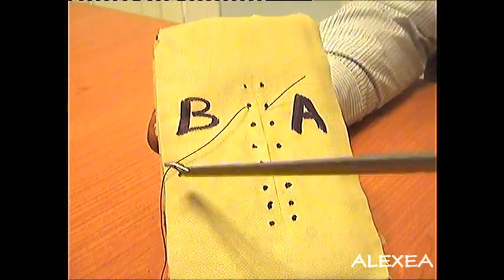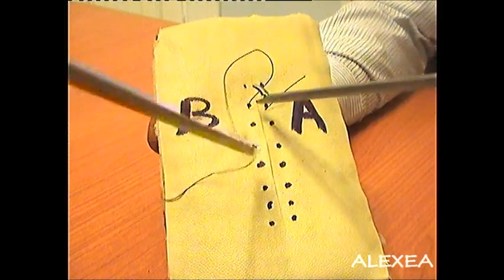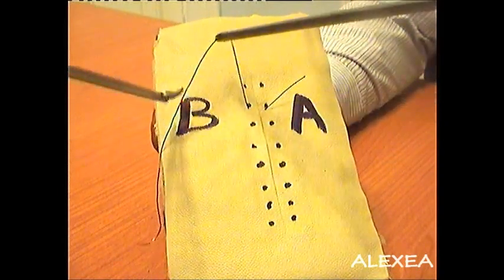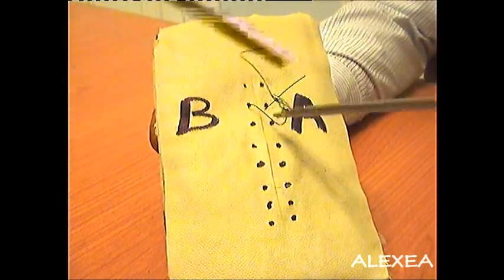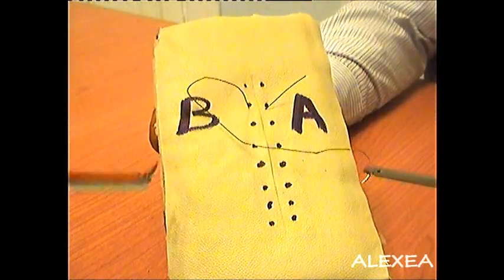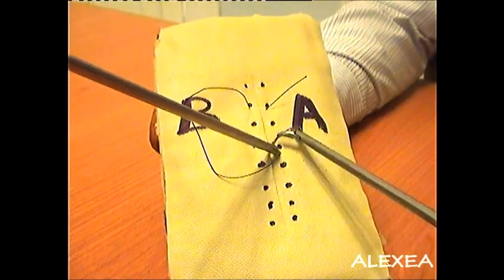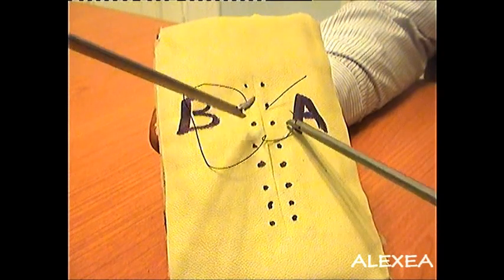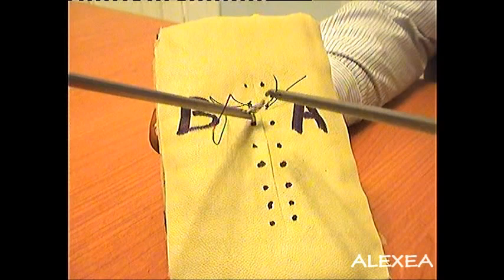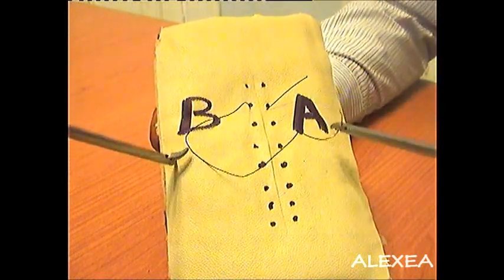Now to prepare the knot tying, one takes the long end of the stitch to side A and holds the needle at its tip. It is preferable to hold the needle in a vertical direction towards the ceiling so that one does no harm to the intestine or any other vital organ that might be lying there. Create a nice C. This is the C.